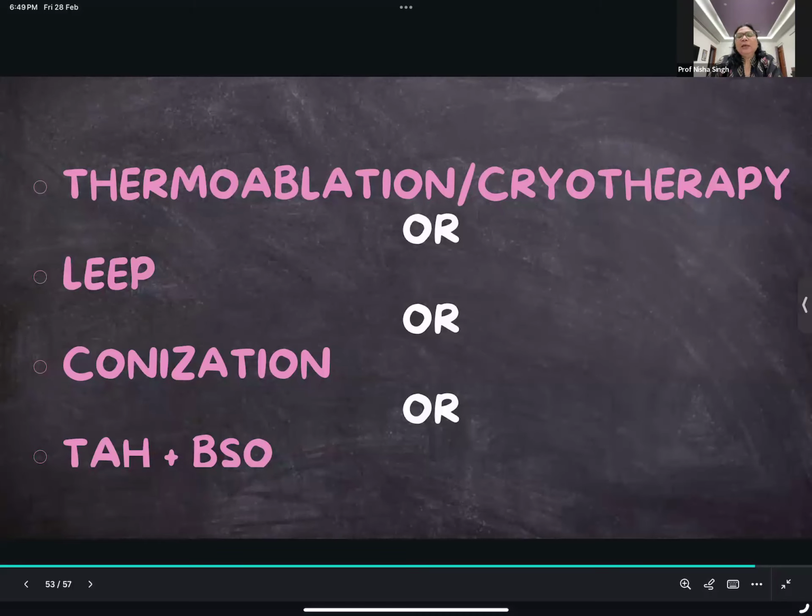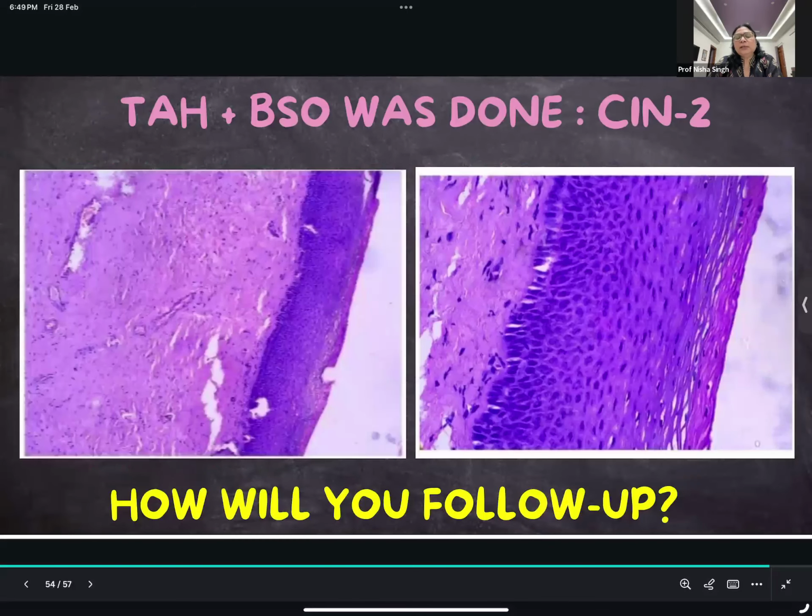The important thing is that many times gynecologists feel, let's do it, it's her age, she's postmenopausal. But if it is invasive, you have done an incomplete surgery, and that is what we do not want to do. So although it will be a two-step, doing the cone and then the hysterectomy, if the cone margins are free, then the job is done. And with this clinical picture, with this colposcopy of high grade but the biopsy not corroborating, we can review the slides again.